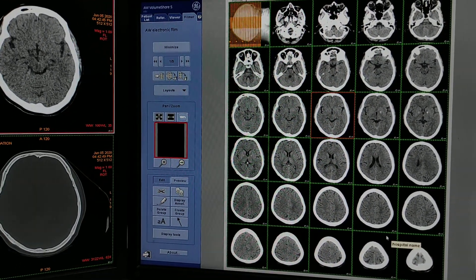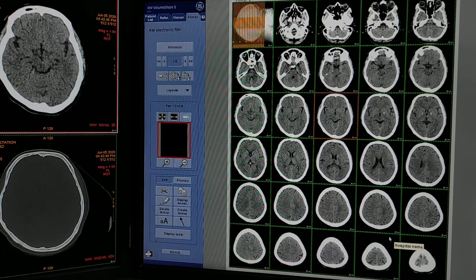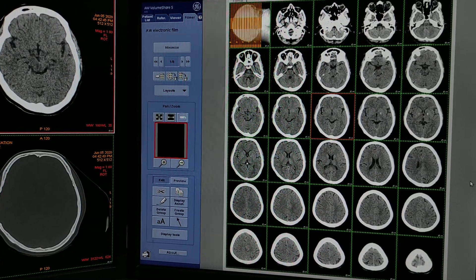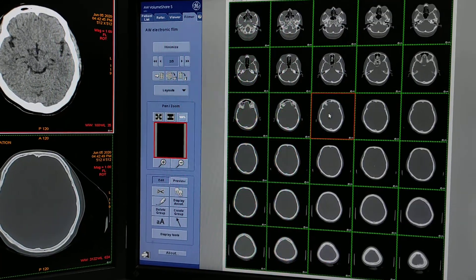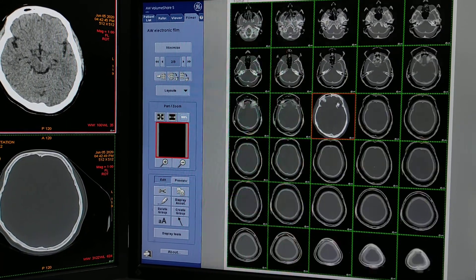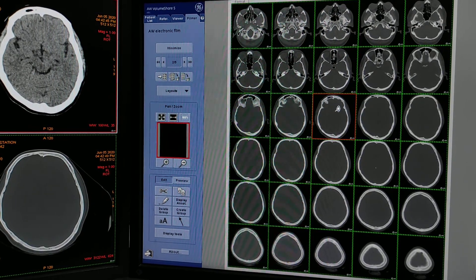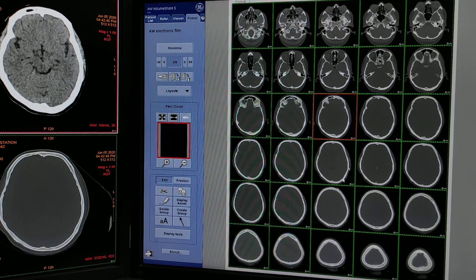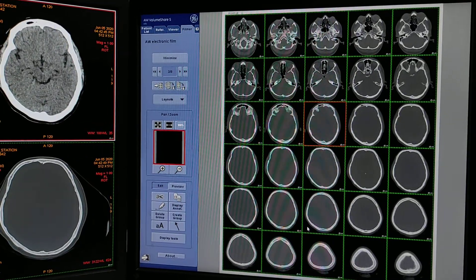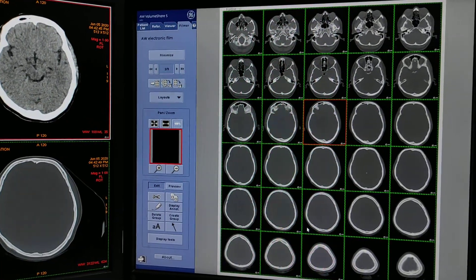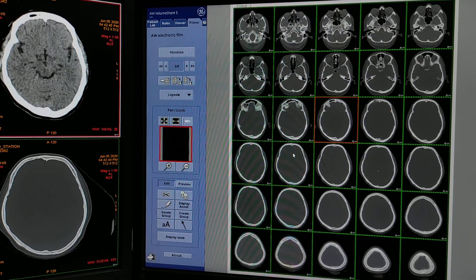If the patient is having trauma and you need to give a bony window, select the same format — 5x6 — and enter the same images and give this much zoom. The first film is for the bony window, the second film is also for the bony window.